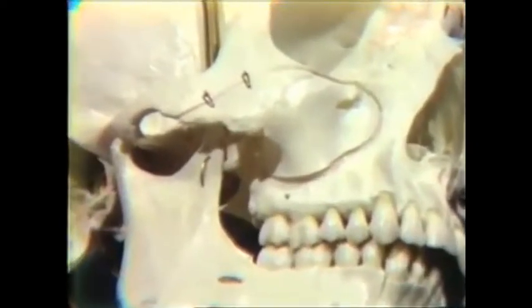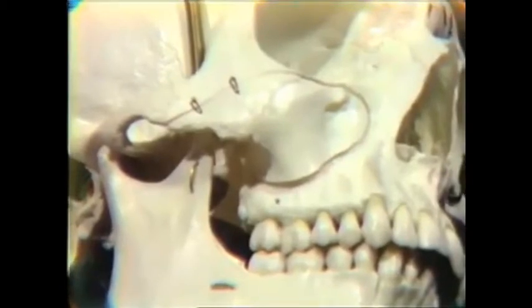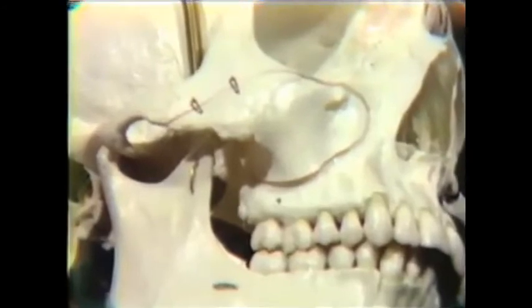And at the time when we're drying the mucosa, we can very easily palpate the malar strut or the zygomatic process because our initial puncture has to be made posterior to it and well out in the vestibule, so that as we curve and carry our needle to the posterior superior alveolar foramina area, we will stay close to bone.